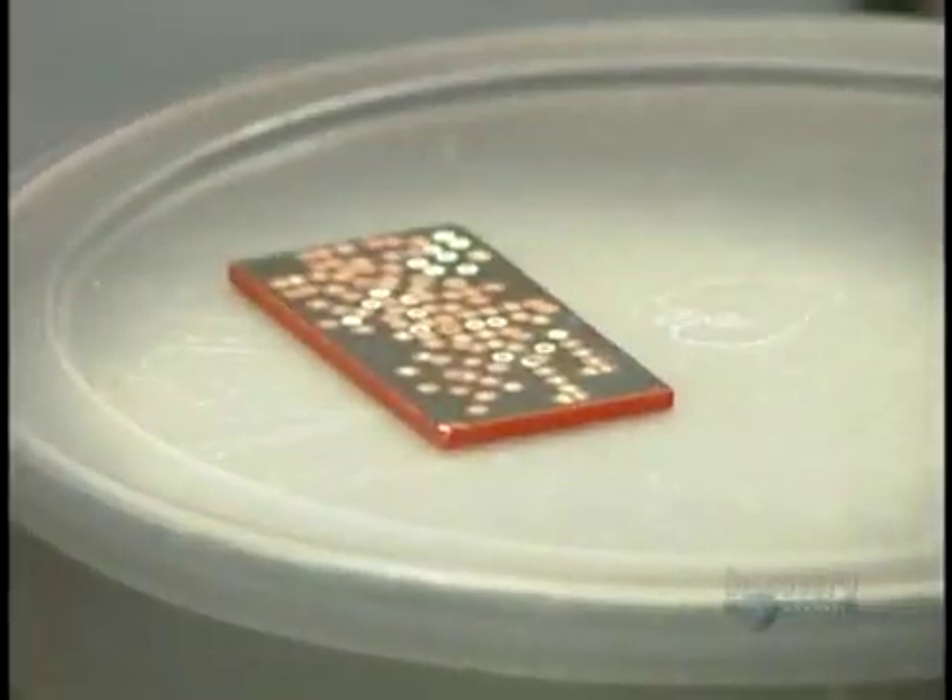Before every operation, the surgeon tests the equipment. He fires the laser on a metal plate to test its energy level.